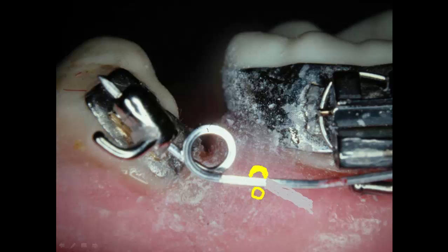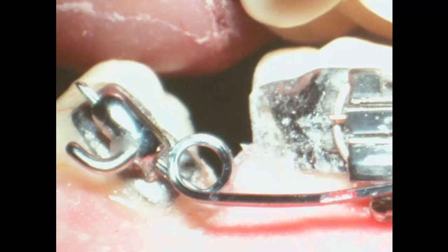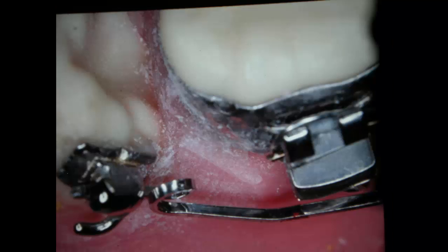Now, let me show another view. This is the blown up view. Now, looking at it from the top, if you've got braces on the other part of the tooth, or this tooth is inside, you can put this and then you can come out with a wire and then make the spring. You can make the little loop and then come out with it and then go back across and then come back up to the regular arch wire like that.